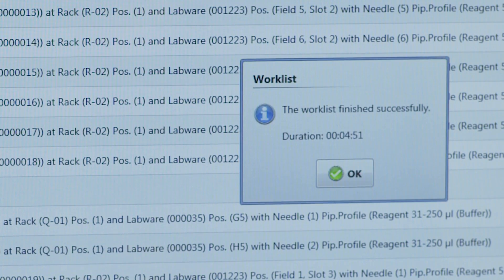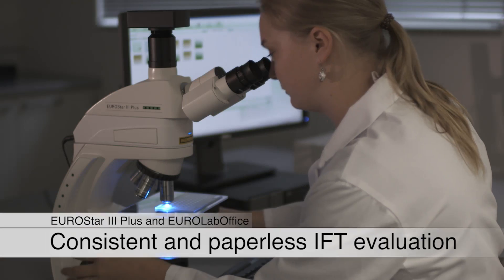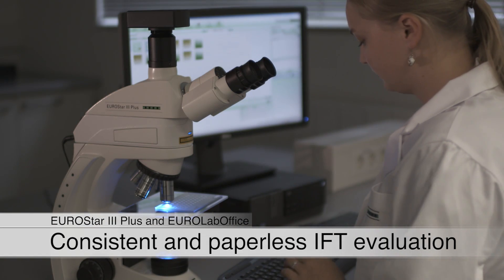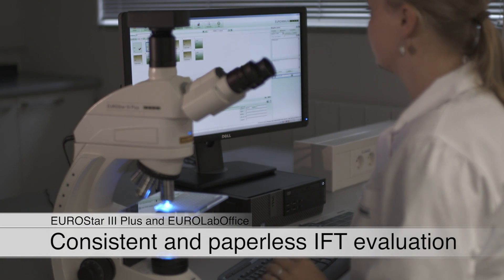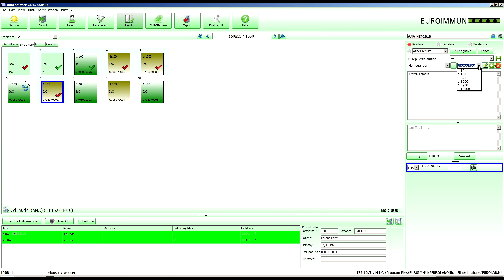After the incubation, the results can be entered into EuroLab Office paper-free and directly at the microscope for more efficiency, comfort, and safety.